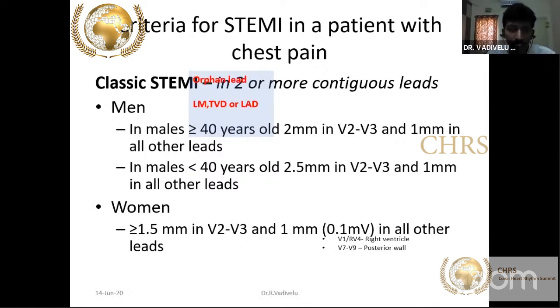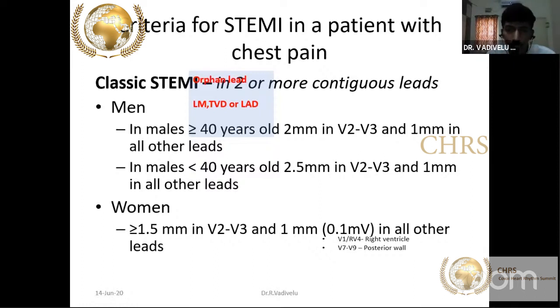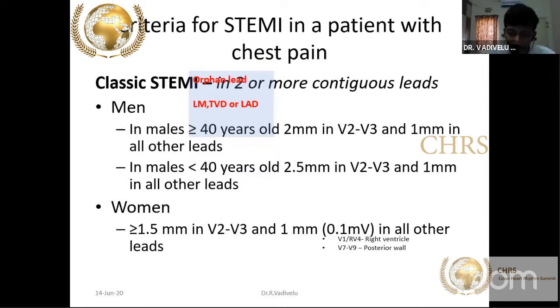To call ST segment elevation significant, it should be present in two or more contiguous leads. For anterior MI that is V1–V4; for inferior MI it is leads 2, 3, AVF; for lateral MI it is lead 1, AVL or V4–V6. The ST elevation should be at least more than 1 mm in amplitude. For posterior wall infarction and right ventricular infarction, even ST elevation of more than 0.5 mm is sufficient.